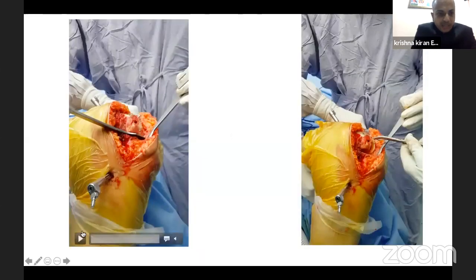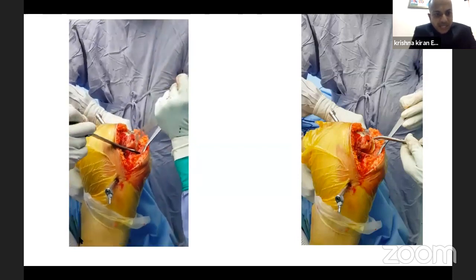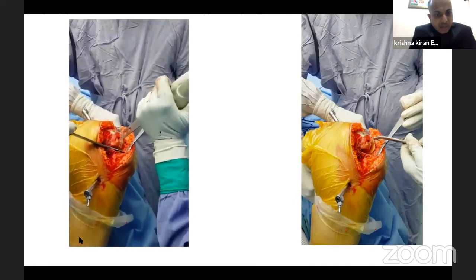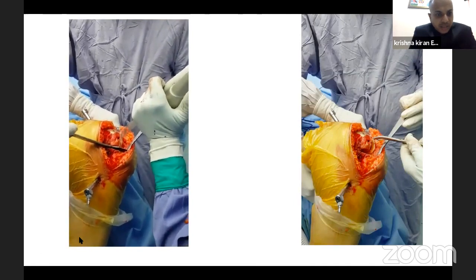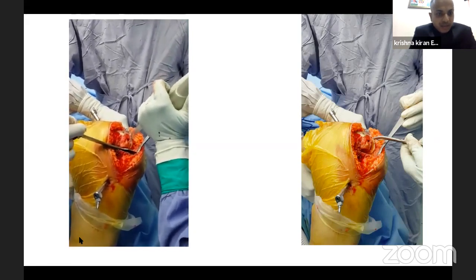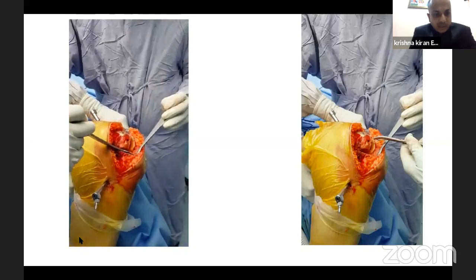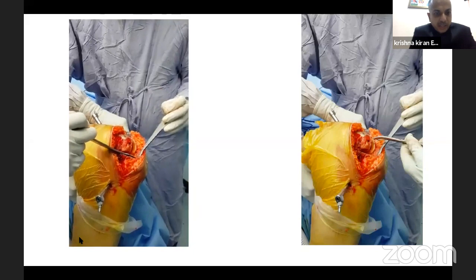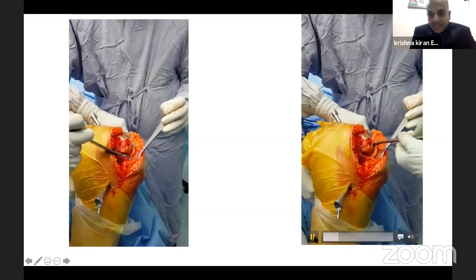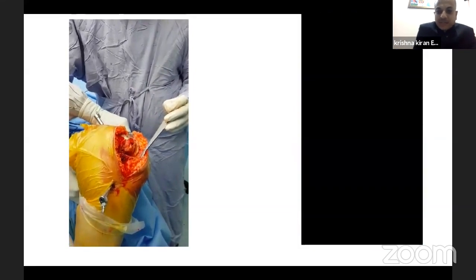So in this particular case, we did a partial lateral condylar osteotomy, and it is a relatively simple technique where you take one quarter of the condyle, take a saw and just take it off. As we remember rightly, the posterolateral corner along with the popliteus and the lateral collateral ligament constitutes a single structure which is attached to the lateral epicondyle and slightly anterior to it. By removing this structure and mobilizing it distally and posteriorly, we are able to correct the deformity both in extension as well as flexion.